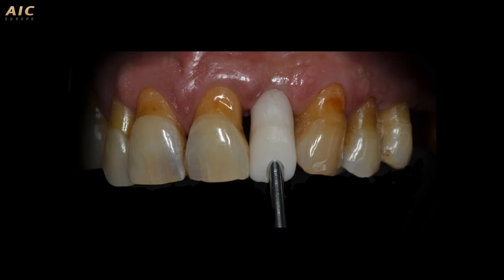I'd like to show you a 3D printed prototype of the crown with the normal emergence profile of the screw.